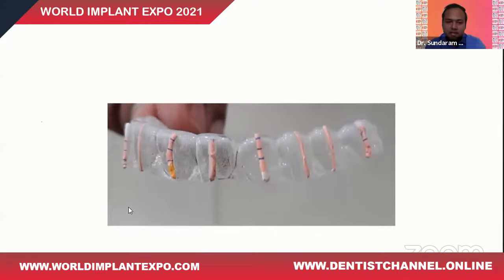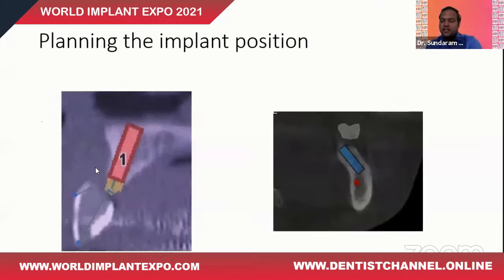And what would be the image that you get in the CBCT is something like this. As you can see in this picture, the GP points are highlighted as radio-opaque lines, telling us where the future crown is going to come up, what the adjacent available bone is, in what angulation, and where exactly the implants are going to come. So this is the idea that our CBCT with specialized preparation is going to give us.